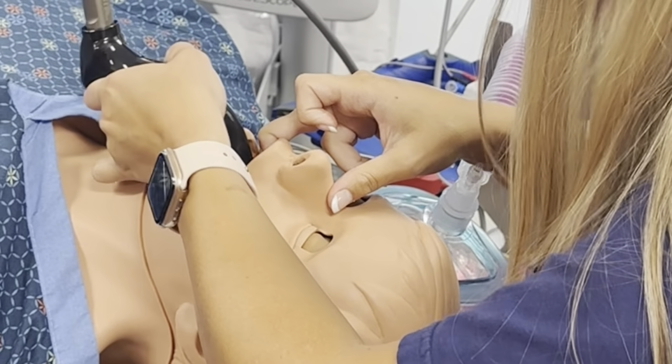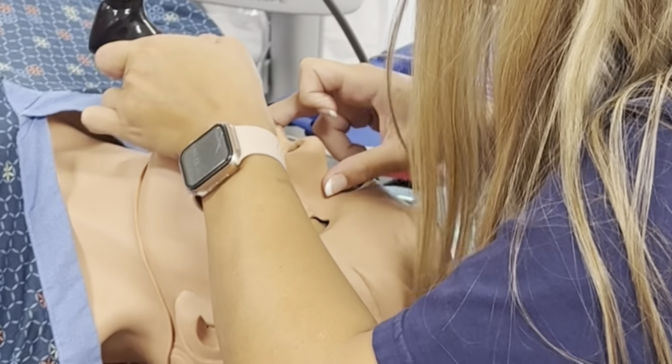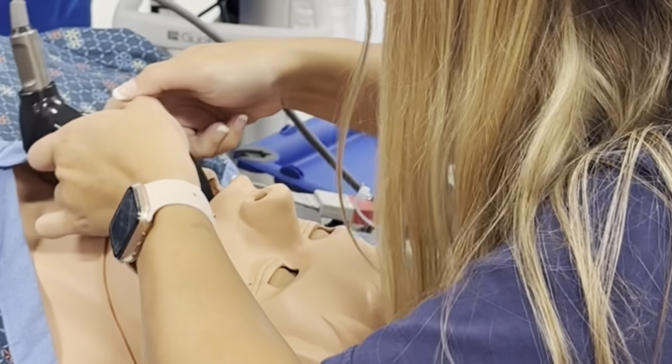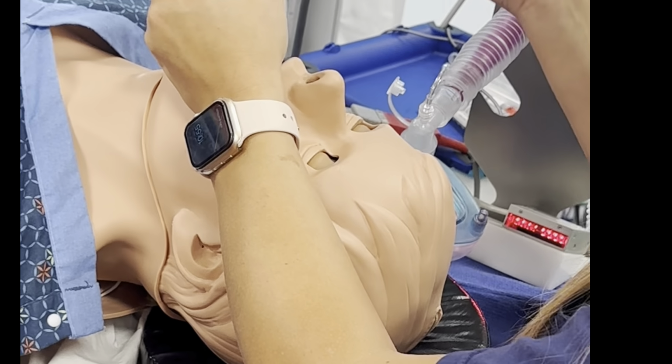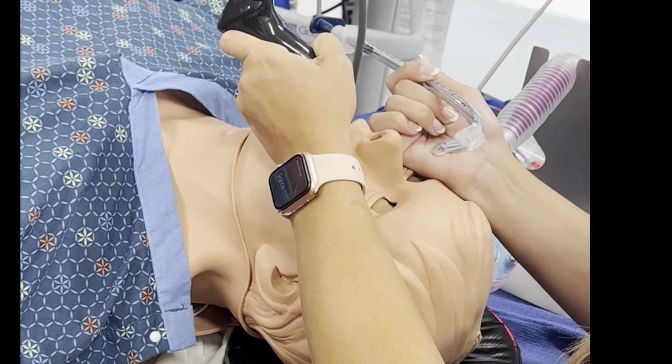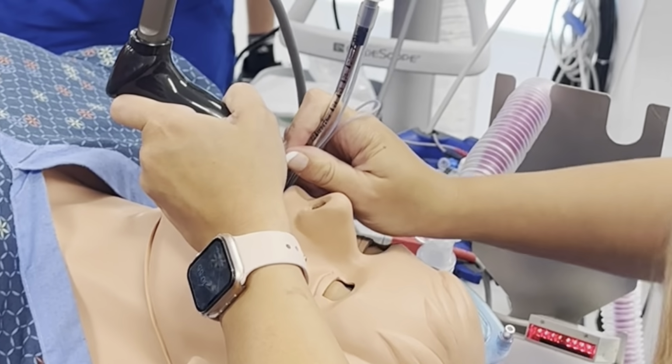So what she's doing is she's taking the blade into the mouth, and she wants to get a view of the vocal cords so she can pass the tube through the vocal cords. I want to go through the vocal cords into the trachea, and so we can breathe for both lungs. You'll see she's going to put the tube in there. So it's through the vocal cords.